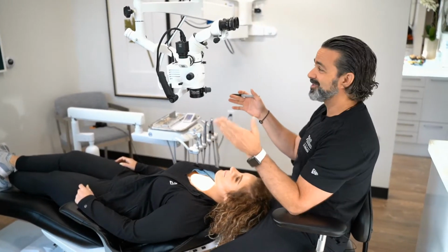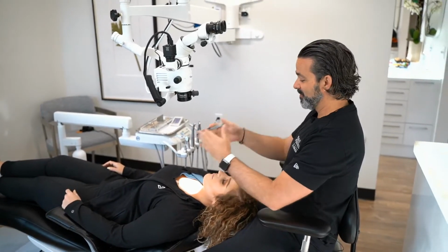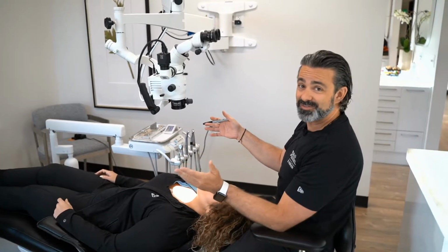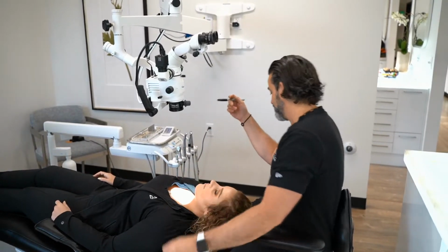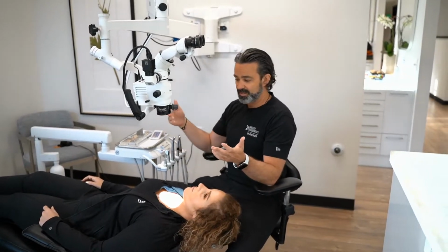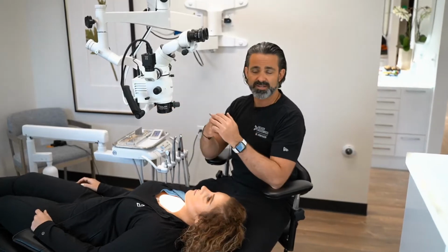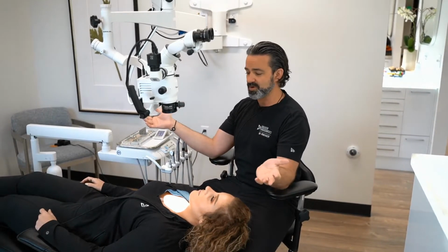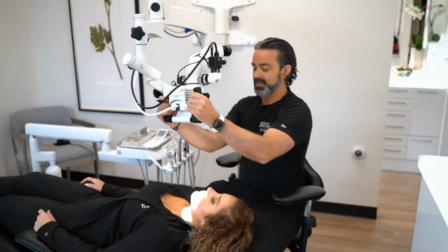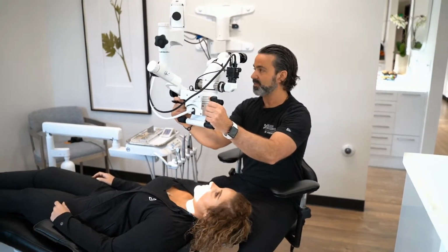So the one thing, when you're worrying about focus and working in the mouth, working in the 12 o'clock position is phenomenal. It's awesome. Now, I know a lot of guys will come in this way, and I think that might be the way you were taught in dental school, and you might have practiced your whole career right here if you're a right-handed provider, and that's fine. And what it does is it kind of puts the microscope like this.